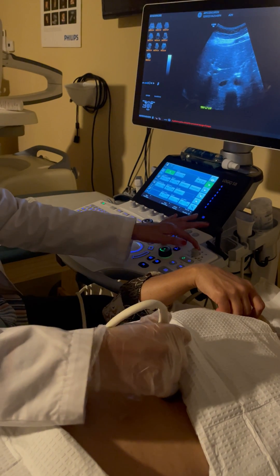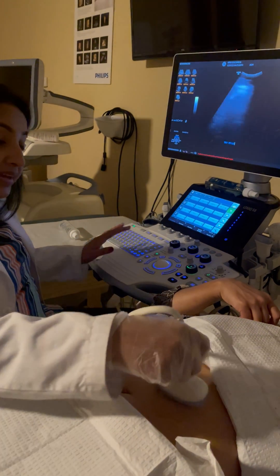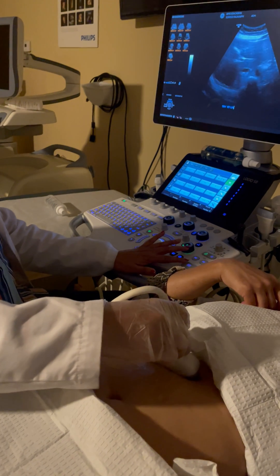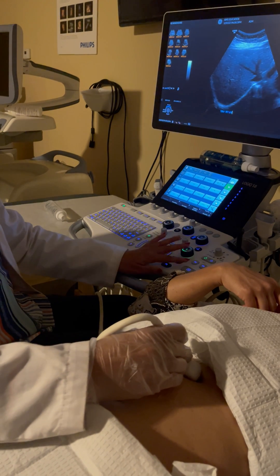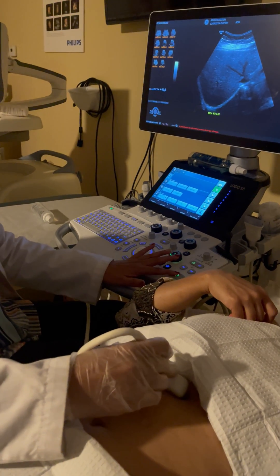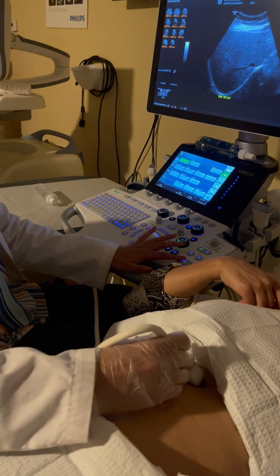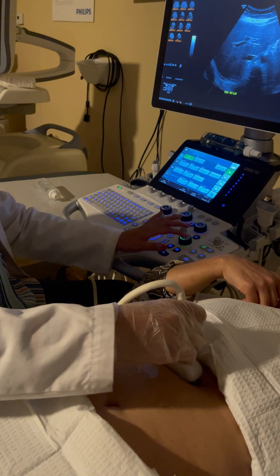The next images are of the right lobe to include the three hepatic veins. I place the transducer parallel to the ribcage in a transverse oblique position. When the patient breathes in, I angle all the way toward the diaphragm to include at least two hepatic veins. Then from the same position I angle out slightly to get the portal vein bifurcation.